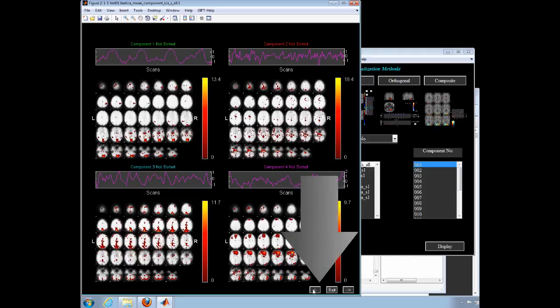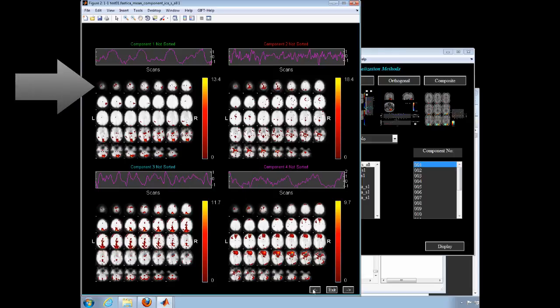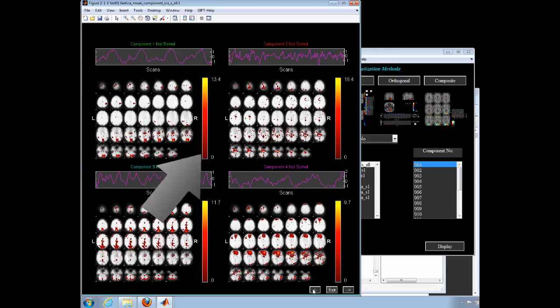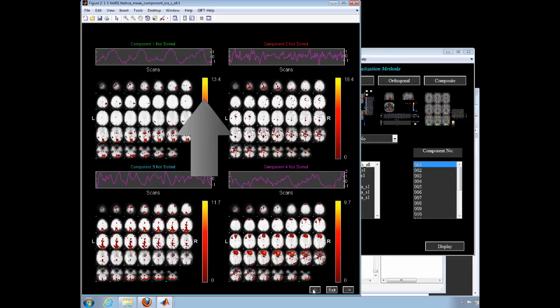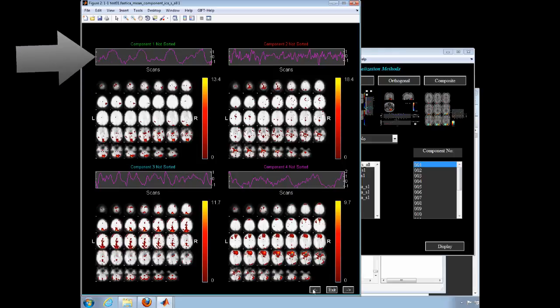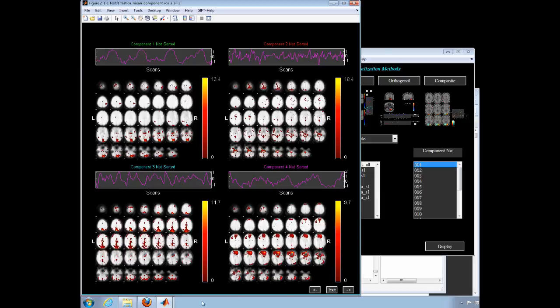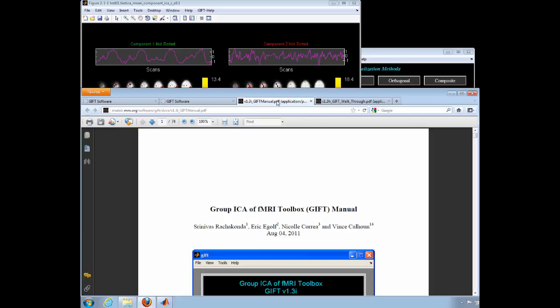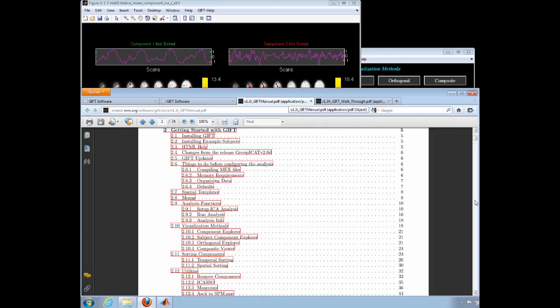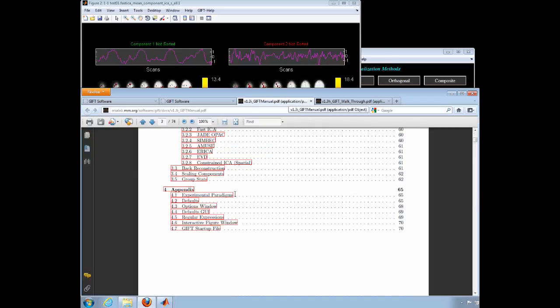The images include all slices moving from the top of the skull at the top left to the bottom. Red indicates some activation, and more activation is indicated with brighter yellow colors. Notice that above the figures for each component, there is a time series to show how that pattern of activation changed over time. This was a block design with two conditions. A visual task for each visual field. See the appendix in the manual to learn more about this experimental paradigm.